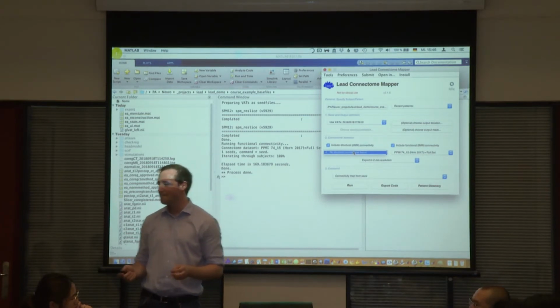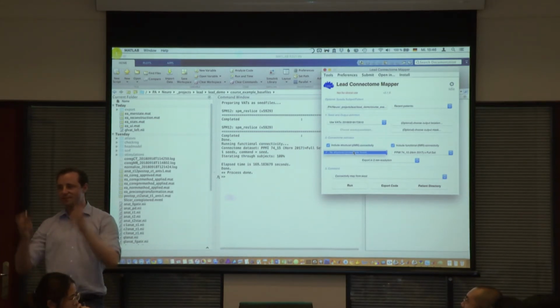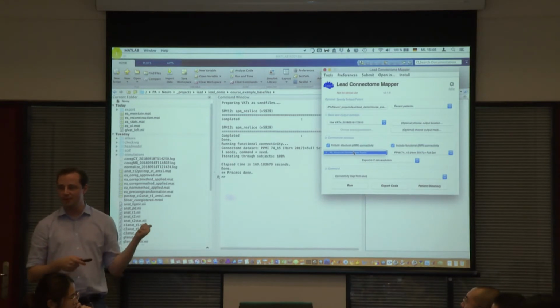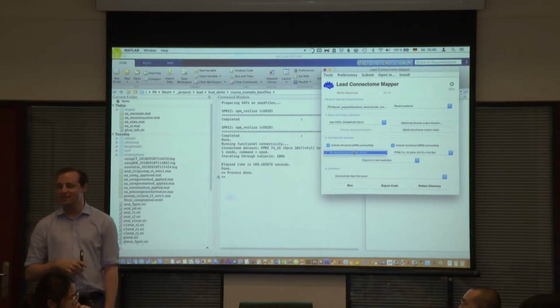And be able to visualize it like that? Yes, but it's really different data, right? So it looks like streamlines in the Nifty, so it would be much more noisy in surface. But today you were showing the fiber track formation from electrode to electrode and changing it. Yeah, no, that was in the visualization mode. Yeah. So it's a bit different.